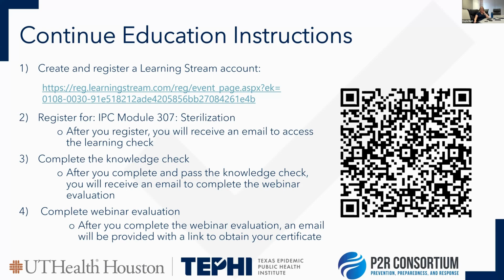There's flash sterilization that I didn't talk about, which is not recommended. That's for some other things, and that's a more tricky situation. But if you have a process in place in your organization, especially when it comes to sterilizing, you should never modify from it. That's the best. Because if something happens, they're going to specifically ask you why you veered from your processes and procedures, and especially if it's a negative outcome, it can open you up to more issues down the road.